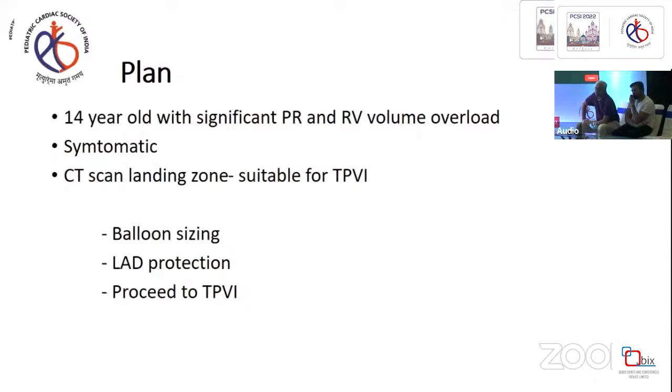But actually, my strategy of doing this case, which is something I designed myself, is I access all the groin: left femoral artery, left femoral vein, right femoral artery, right femoral vein. So we started off with right femoral vein, which is the one I use for implantation of the valve. And then right femoral artery is for putting the pacing catheter in the LV.